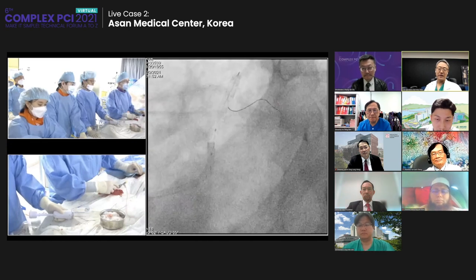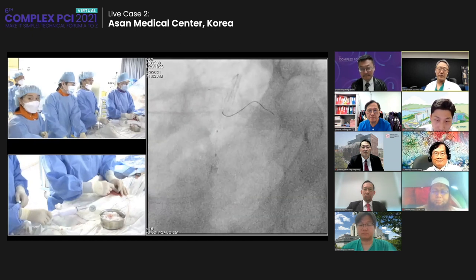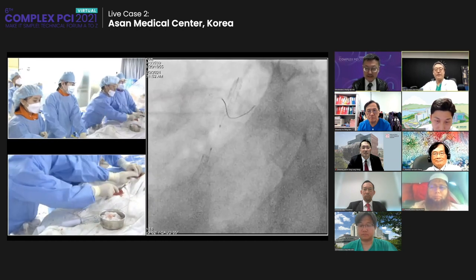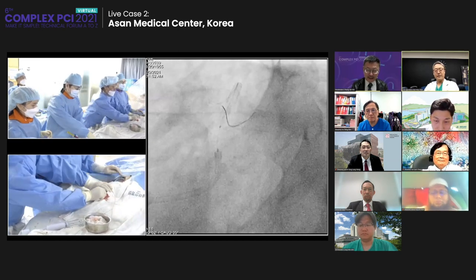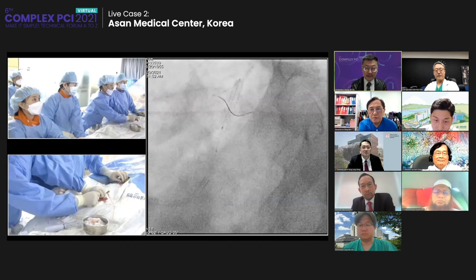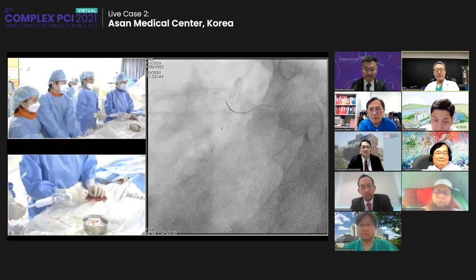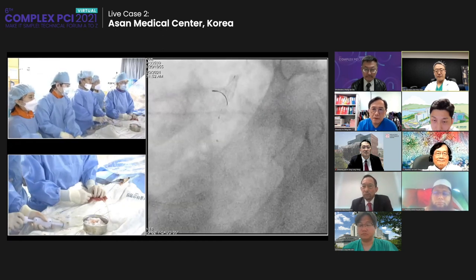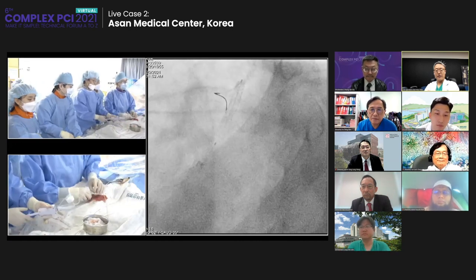And then we advance more over here. With the NC balloon, usually for ISR with a short high pressure balloon, the balloon position maintenance is poor, so it just squeezes in and out. So I would choose a somewhat longer one, 15, which would just fit this lesion. We put the lesion at the center and avoid the slippery part. Further inside, I think it's okay. The proximal stent is very far inside. This is a 4.0 in place, and then slightly advanced over here.